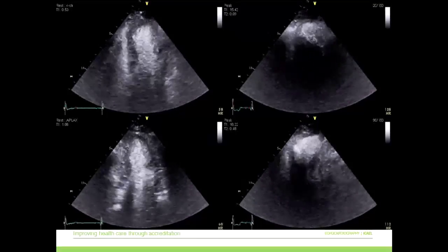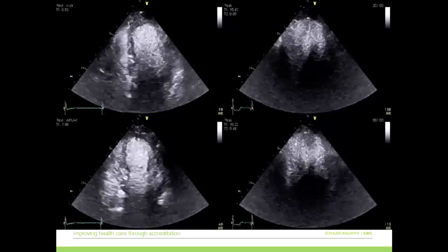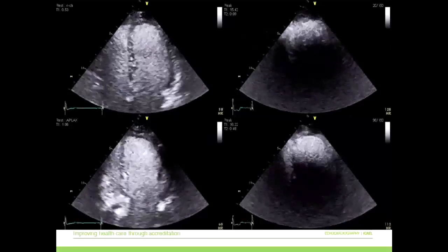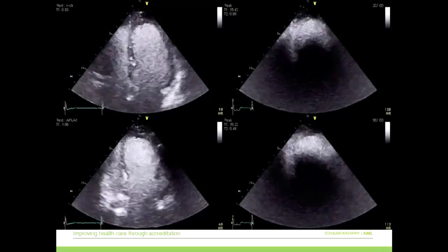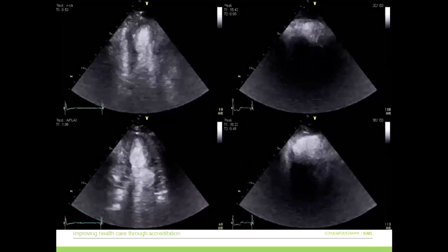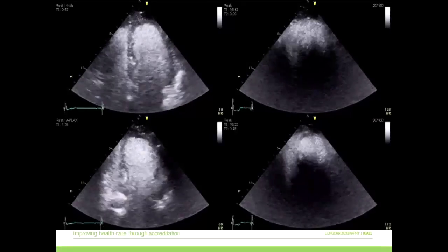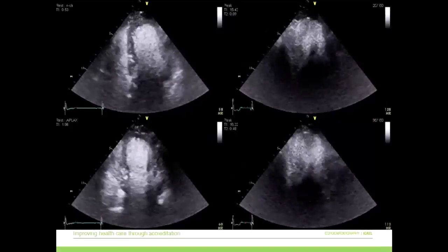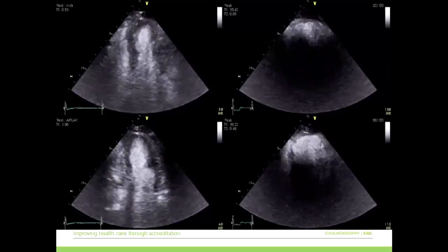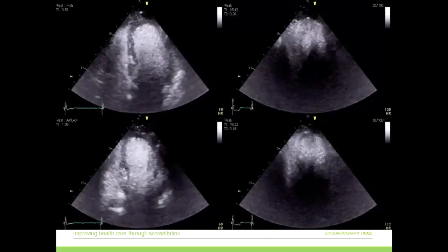Well, not only the person administering the contrast, but also the patient needs to be involved. We need good communication with contrast administration. In our echo lab, in our stress lab, we always tell the patient to let us know if they're starting to get fatigued. We also ask them throughout the stress test how they are doing. Are you getting tired? We also tell them that we like a 90-second warning before they need to stop. So at 90 seconds, we inject, and we have them walk 90 more seconds to avoid any chance that this will occur.